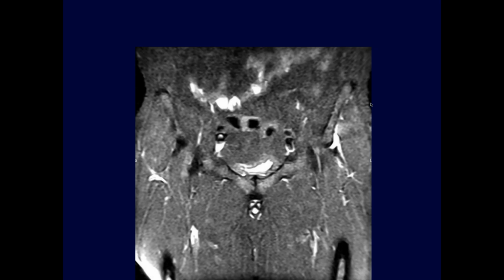It has to be in that area, so these are some other images. I guess you could have some injury to kind of the gluteus attachments along the iliac. Gluteus. But the gluteus doesn't attach, that attaches to the femur, right? So there, I mean, there's proximal attachments. What is this right here? I mean, that's the iliac. That's the superior acetabulum. Well, what is this called? It's the anterior iliac spine. Uh-huh. Okay. So I guess then what comes off the anterior inferior is the rectus.